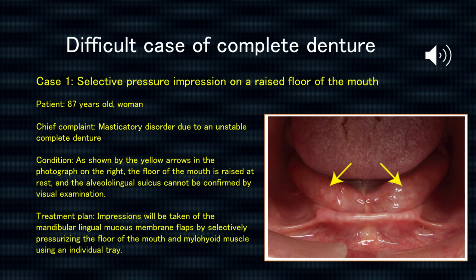Treatment plan. Impressions will be taken of the mandibular lingual mucous membrane flaps by selectively pressurizing the floor of the mouth and mylohyoid muscle using an individual tray.